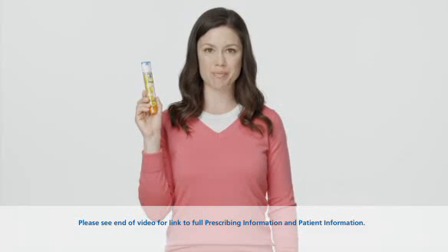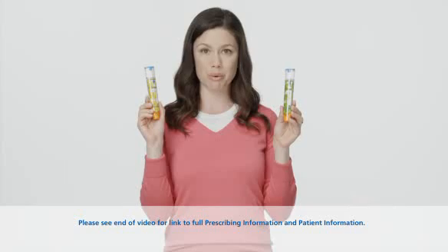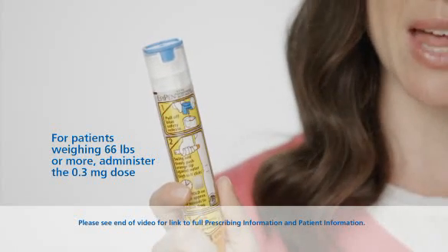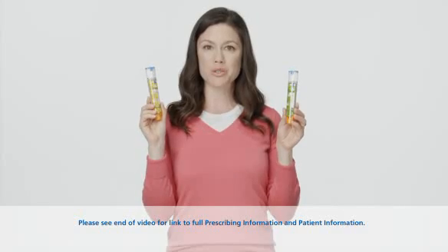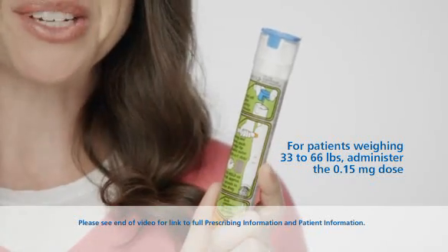This is the EpiPen Auto Injector. It comes in two strengths: one for patients weighing 66 pounds or more, which has a yellow label, and one for patients weighing 33 to 66 pounds — that's EpiPen Junior — which has a green label.